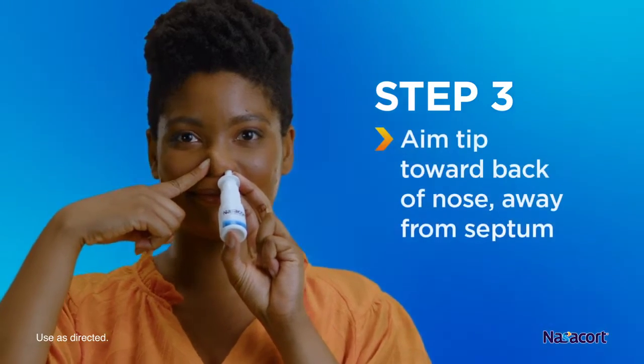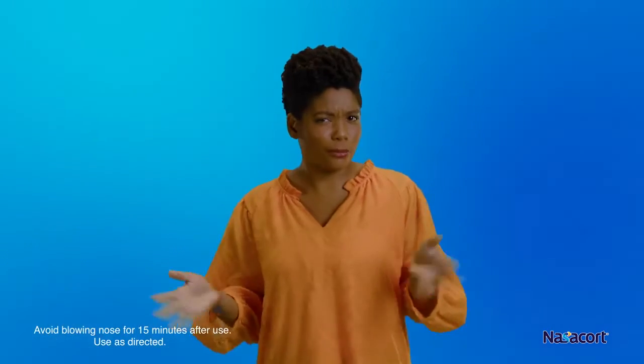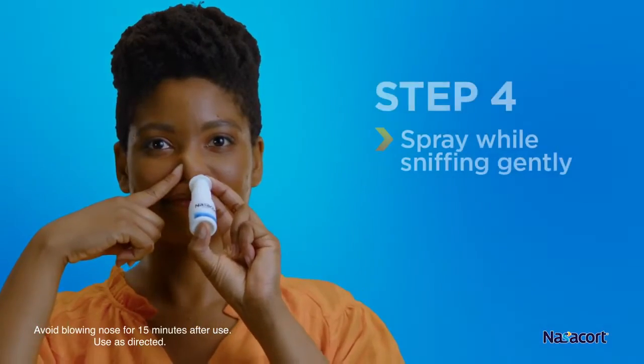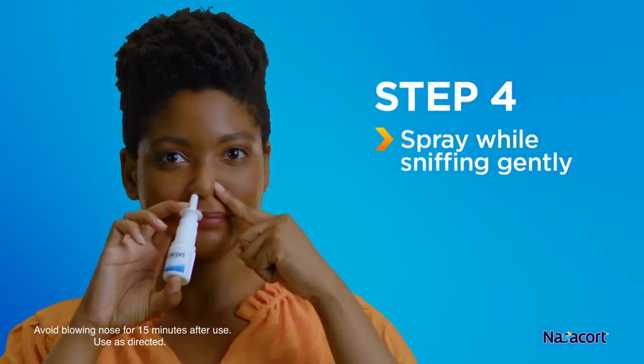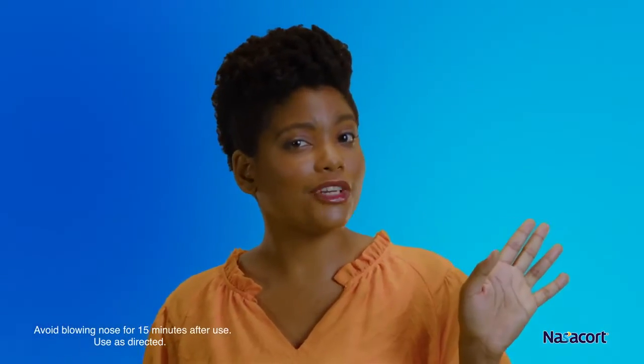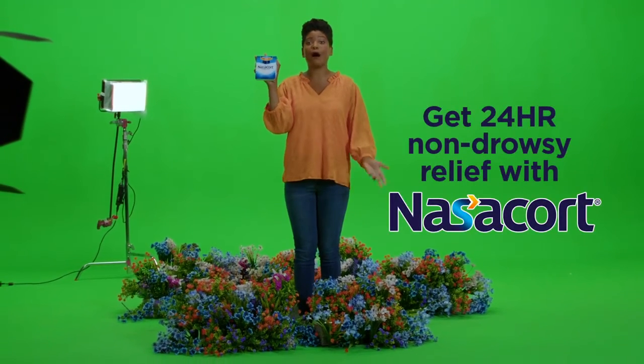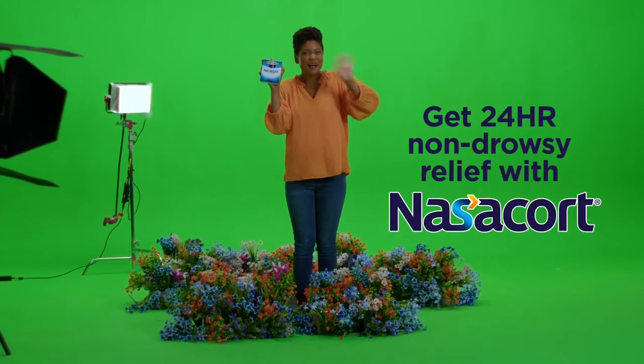Then aim the tip toward the back of your nose, taking care to avoid spraying toward the nasal septum — the wall between your two nostrils. Spray into the nostril while sniffing gently, then repeat on the other side. That's it! Wipe off the nozzle, replace the cap, and you're ready to enjoy 24-hour non-drowsy relief with Nasacort. Bye!